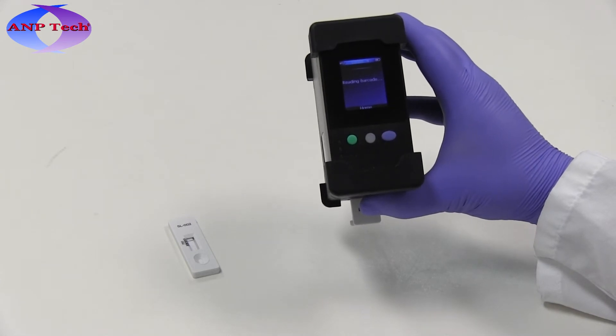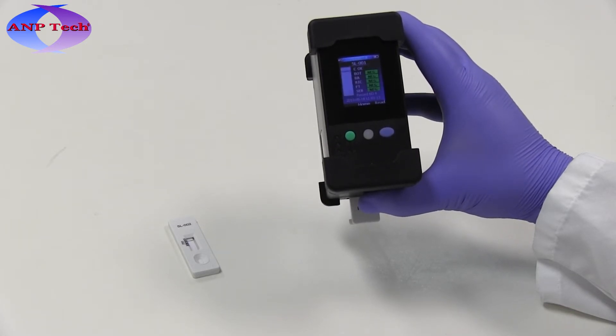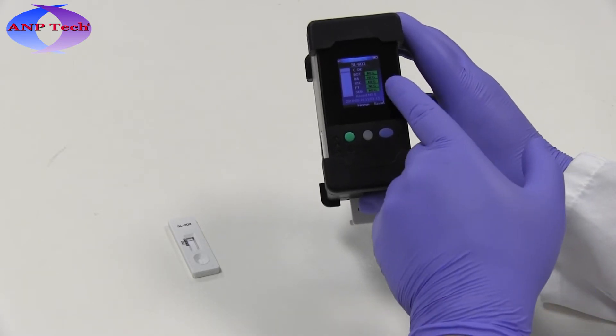Press the blue button under Read Assay to start the automatic analysis. During analysis, the reader will check for the presence of a control line and then automatically display assay results in a color-coded fashion, with green for negative and red for positive results.